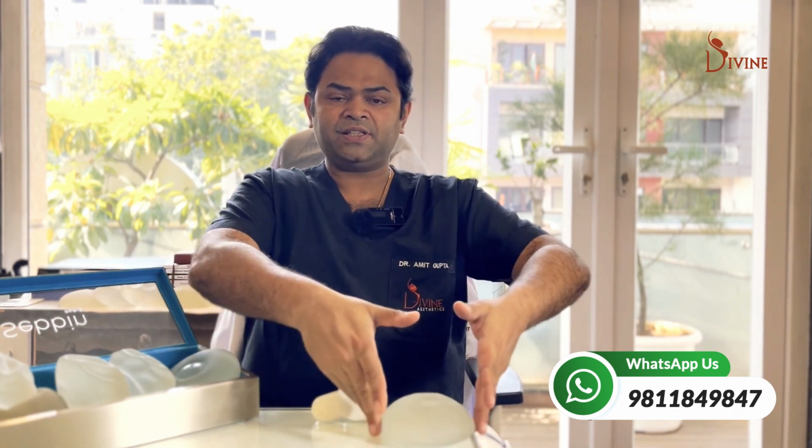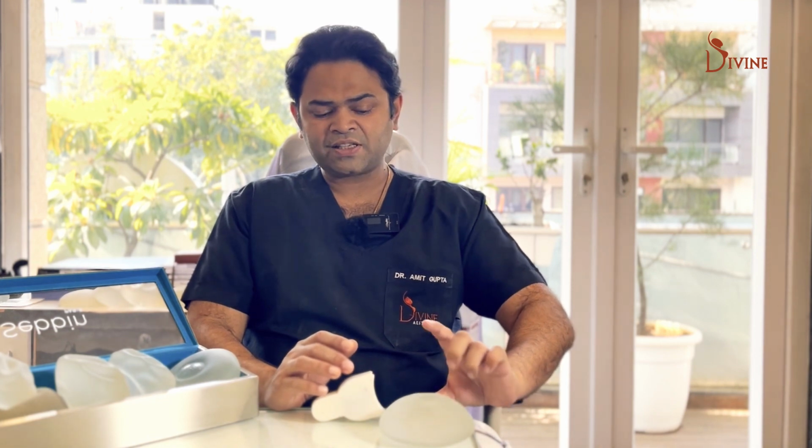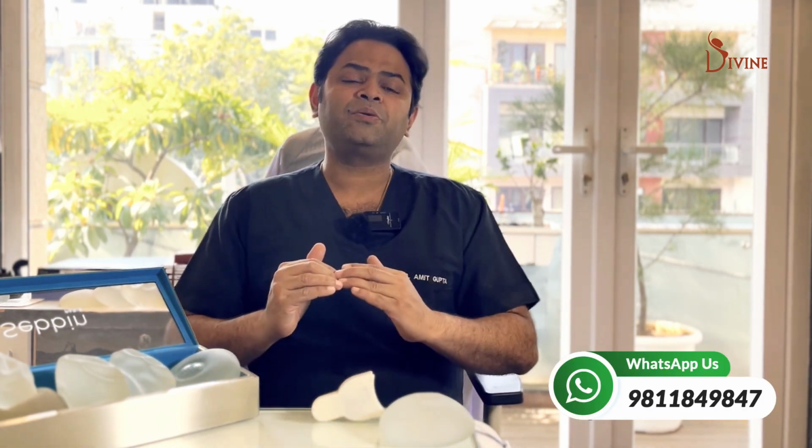So the first deciding factor is the base diameter of the implant, which is this. Then the projection. The projection, if it is ultra high, is able to give a bigger breast. If it is high profile, it gives a slightly smaller breast. If it is moderate profile, it makes it even smaller. So this is how we decide on the size of an implant.